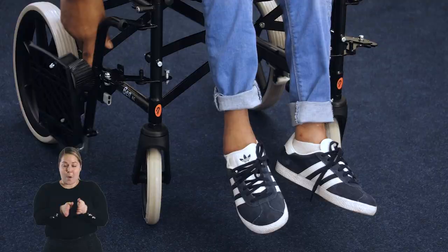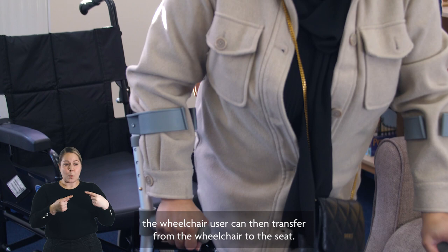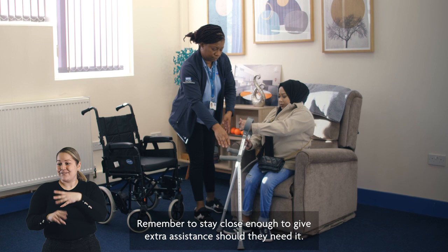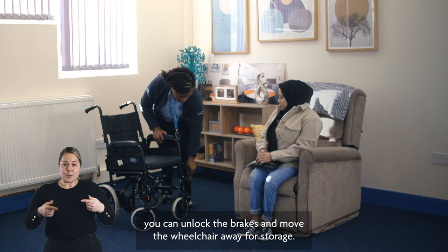Then swing the foot plates to the sides of the chair. Once the foot plates are out of the way, the wheelchair user can transfer from the wheelchair to the seat. Remember to stay close enough to give extra assistance should they need it. Once the wheelchair user is seated safely, you can unlock the brakes and move the wheelchair away for storage.